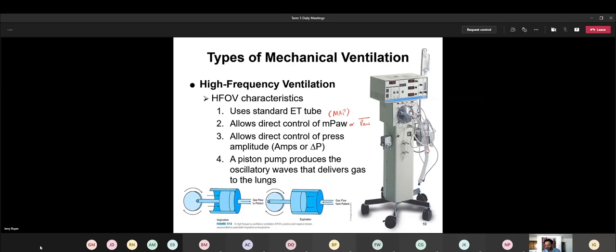Oh, and I forgot to point out something else. This is how we're turning the thing on and off. It just comes down to flipping the switch here to turn it on and off. And then while I'm here, I mentioned that this is, of course, our air and O2 blender that's connected here on the outside of the machine.